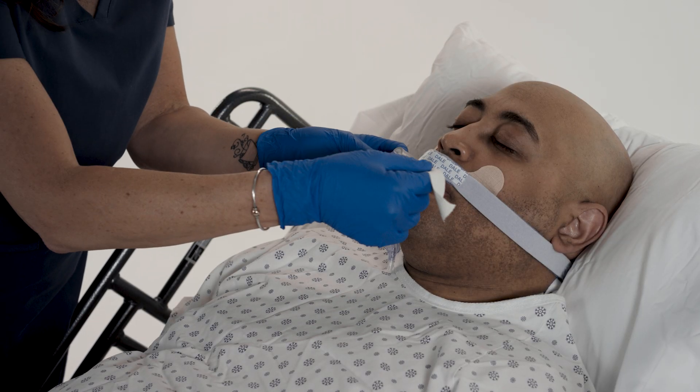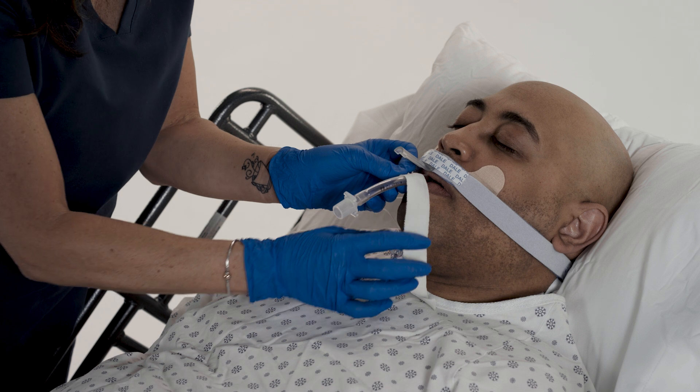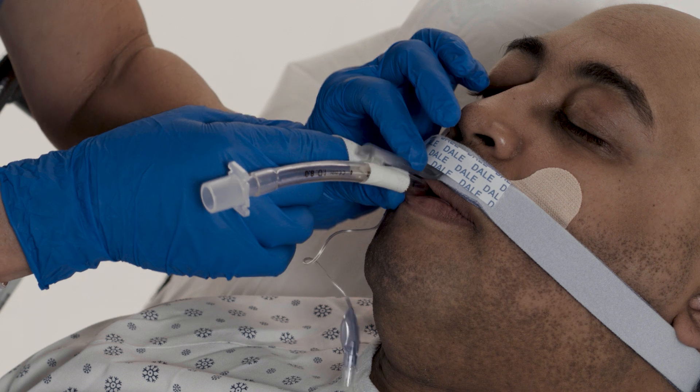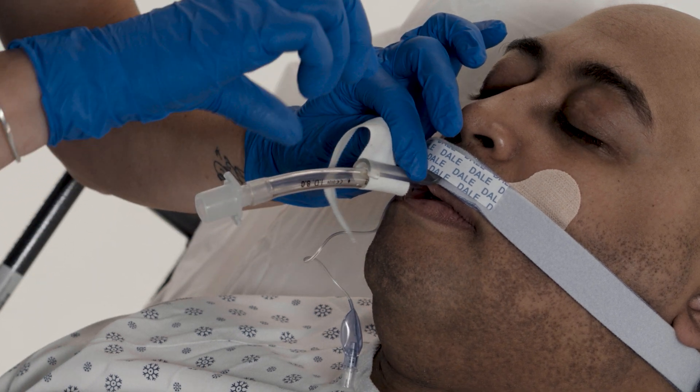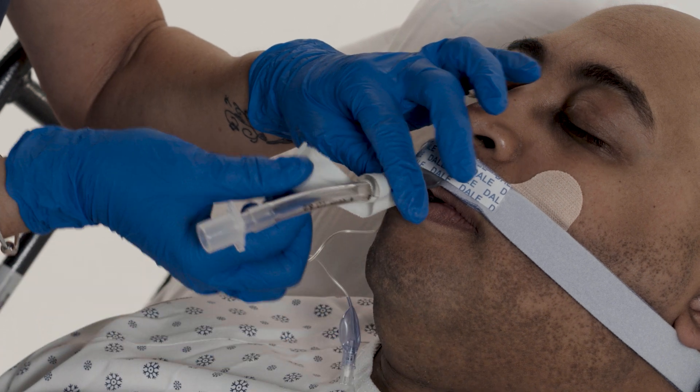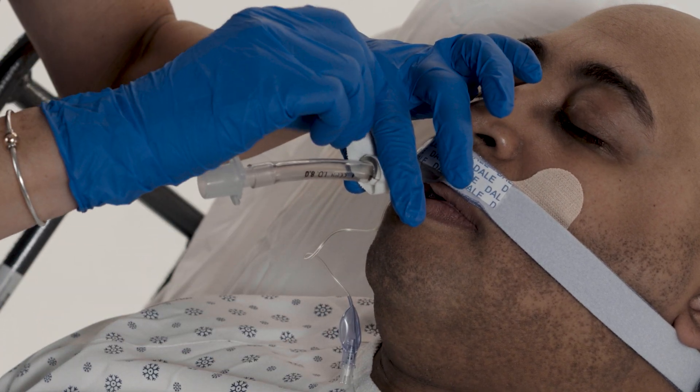With the tube resting below the channel, wrap strong adhesive tape one time around the ET tube. Press the tube channel onto the tube. Firmly wrap tape in a forward spiral motion around the channel and ET tube to secure.